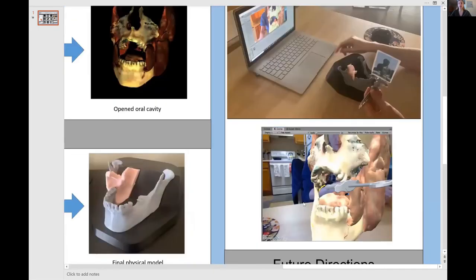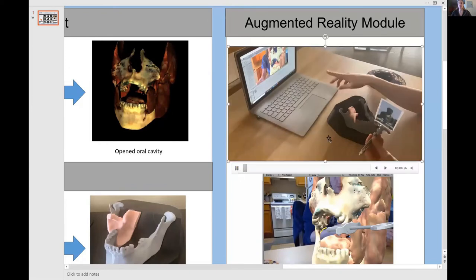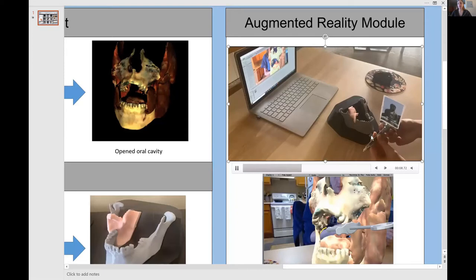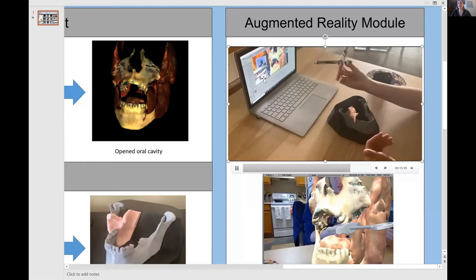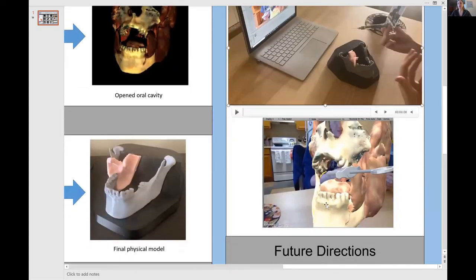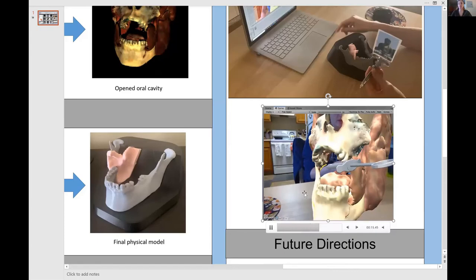I have two videos demonstrating this product in use. The first shows the physical model and the computer screen. We have the 3D printed base, mandible, and soft tissue. I also have a dental syringe with the unique image identifier, which allows the camera to populate the screen with the 3D modeled dental syringe. The 3D dental syringe can be manipulated and interact with the oral cavity model. The syringe moves in relationship to the movement of the syringe held in my hands, and you can see it interacting with the inferior alveolar nerve, giving a better sense of where the needle tip is in relationship to the nerve.